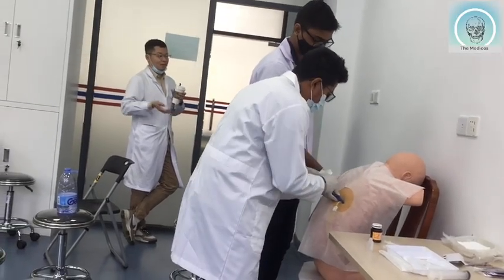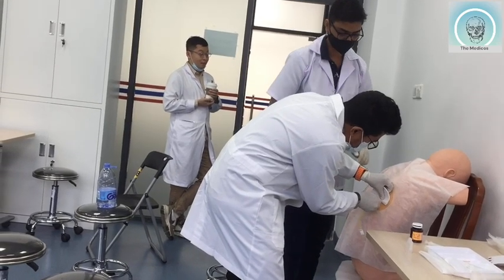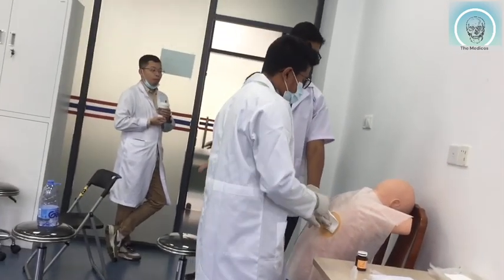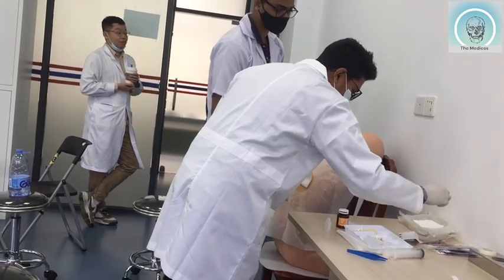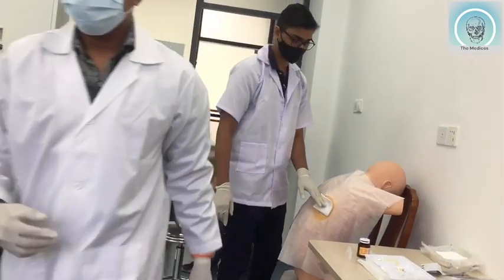In general, sedating medicines are not used during thoracentesis. If sedating medicines are used, you will need to be observed in the office for a few hours after the procedure, and you will need assistance getting home. Patients should discuss these issues with their physician before the procedure.